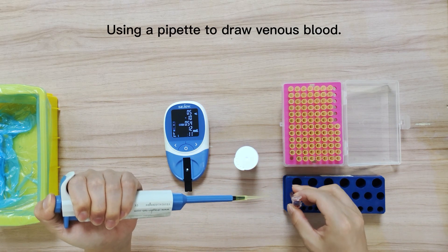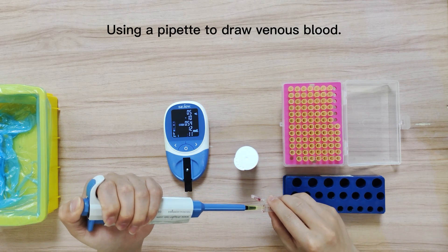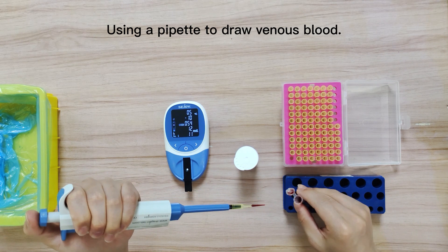Install the pipette tip, press down on the tail of the pipette, and accurately draw 35 microlitres of blood sample.